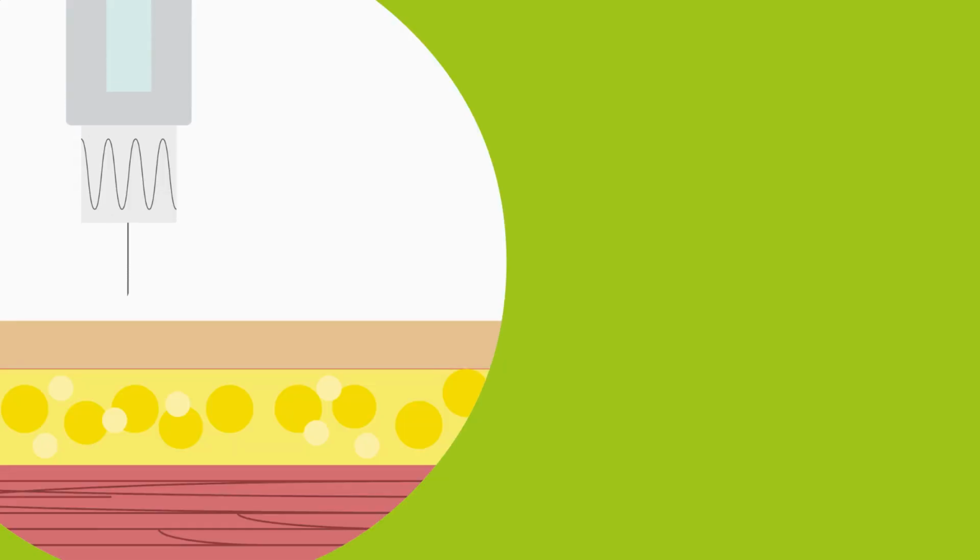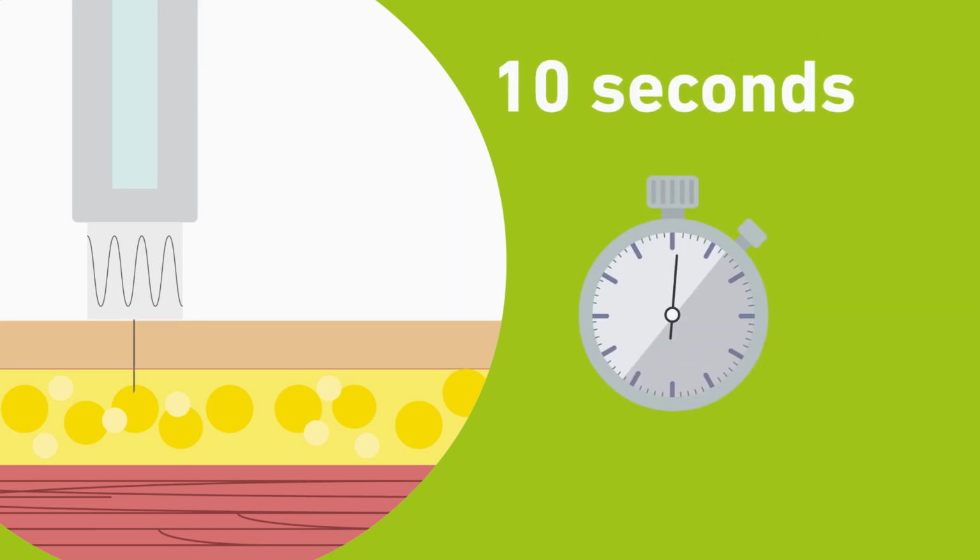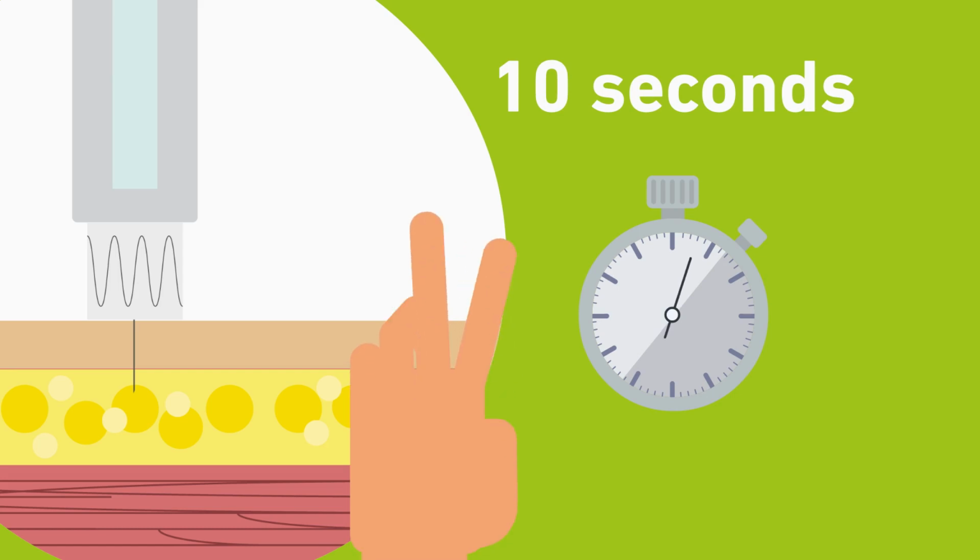When you have injected your insulin or GLP-1, it is advised that you leave the pen needle within the skin for a count of 10 seconds before you remove it. This allows the liquid to be absorbed correctly.